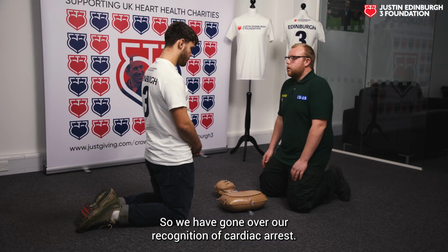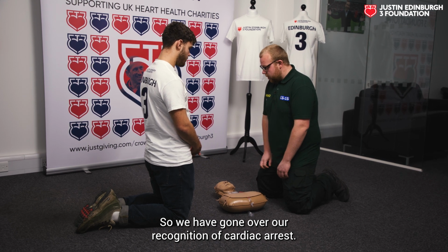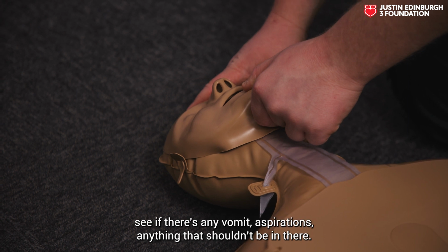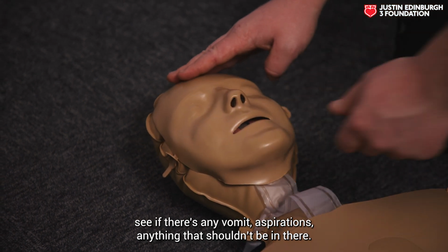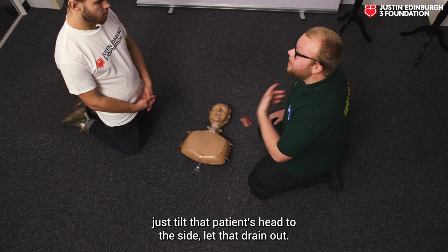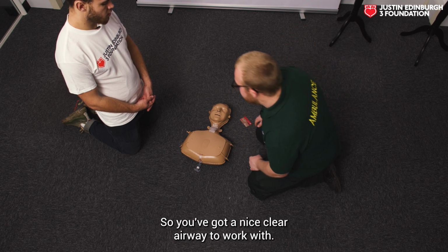Yep, let's do it. Right, so we've gone over our recognition of cardiac arrest. So again, I'm just going to do that head tilt chin lift. I'll have a good look in the airway, see if there's any vomit, aspirations, anything that shouldn't be in there. If there's anything in that airway that shouldn't be there, just tilt that patient's head to the side, let that drain out so you've got a nice clear airway to work with.